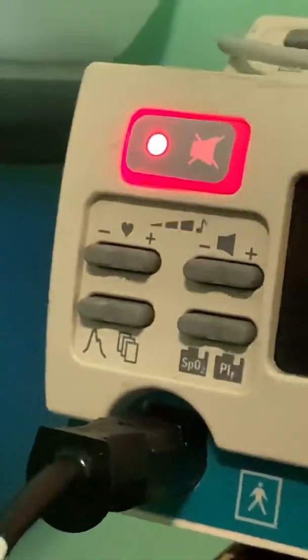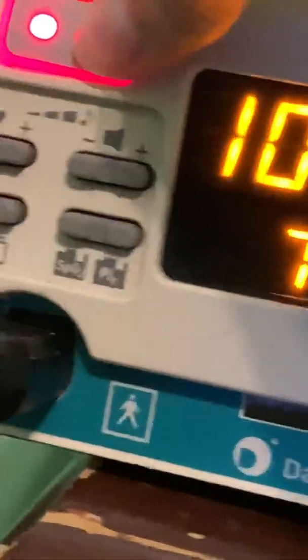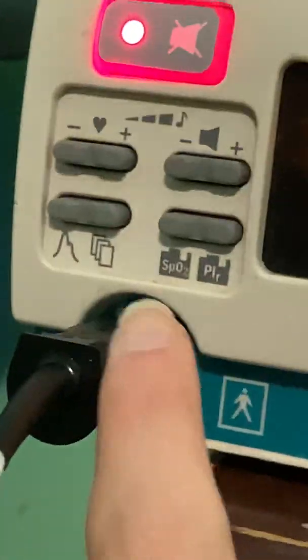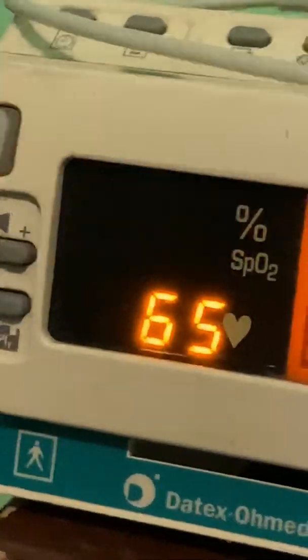To set the all mute, you press this button very quickly three times. I think it did it. You see that flashing bell? That means the alarms are silenced indefinitely — so the patient can desaturate but it won't alarm.